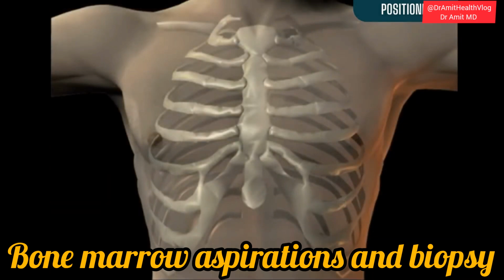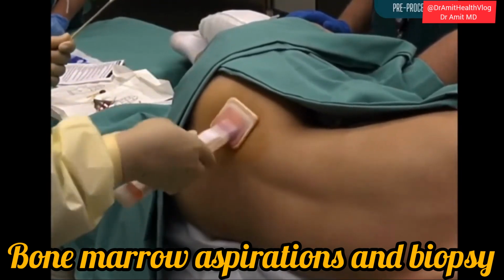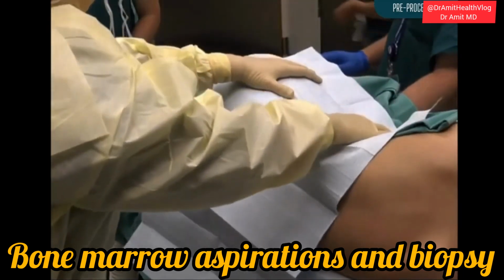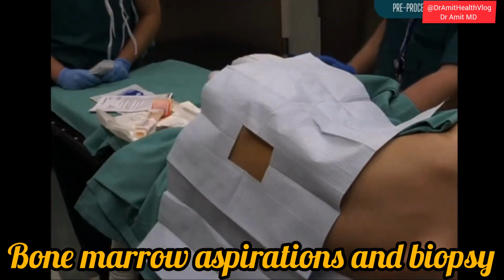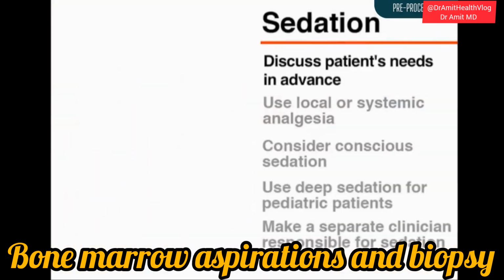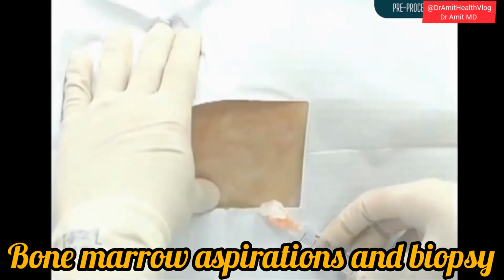a bone marrow biopsy. Once the patient is positioned, the site should be prepped with a chlorhexidine scrub and draped with sterile towels. As with all invasive procedures, meticulous care should be taken to minimize the risk of infection. While the invasiveness of the procedure may not necessitate a sterile gown and mask, the operator should don sterile gloves and adhere to strict standard precautions. Local or systemic analgesia, or both, may be indicated.